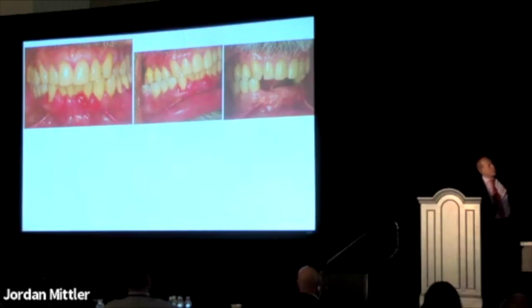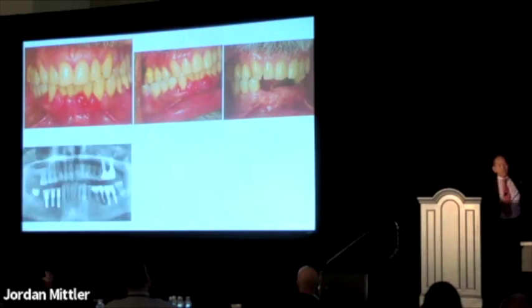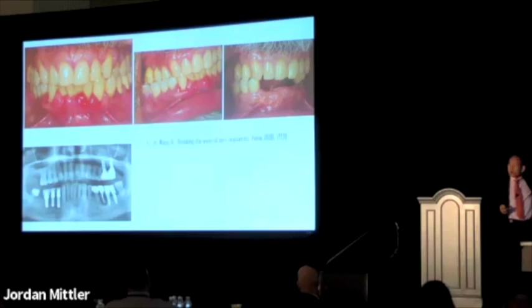You see people with rip-roaring periodontal disease, like this guy coming in, who's partially done and has some implants. The ones that are doing really well, in the guy with rip-roaring periodontitis, are the tissue level implants, which are doing fine, whereas bone loss is going on everywhere else. And we've seen this, and the evidence seems to show that putting the gap away from the bone and a polished collar may be the better way to go in choosing an implant.